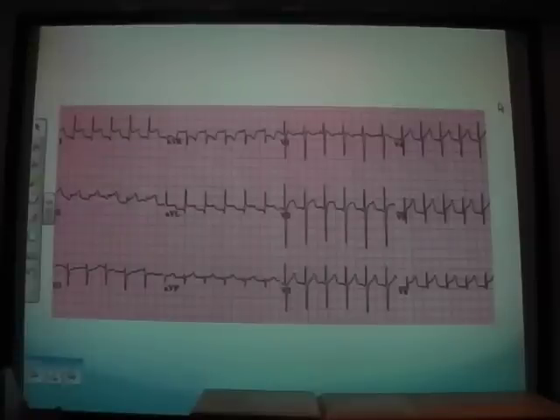I think it's mostly upward going too, but I think lead 1 is very strongly negative. Did you look at lead 3 as well? Yeah, I always check using lead 3. Use aVF as well, don't they? Yeah, you use it.